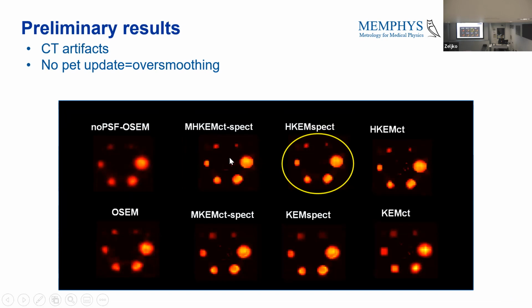And when we use CT information, we saw some artifacts coming from the lung insert. Can you see this? Instead, when we use PET and SPECT information, the artifact doesn't show, and in terms of quantification, we get exactly the same result.